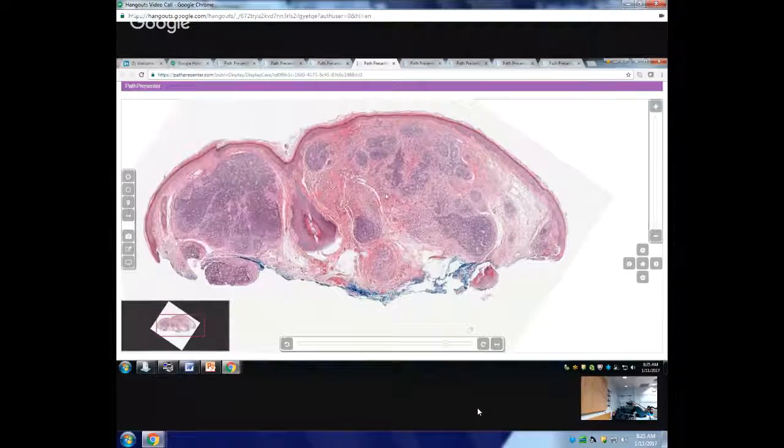When you look at it the first time, it is very difficult to comprehend and put your hand around it. Will I be able to make this diagnosis again? That is the reason I try to tell you what are the features that you want to first rule out. Once you have ruled it out, then you are left with very little options.